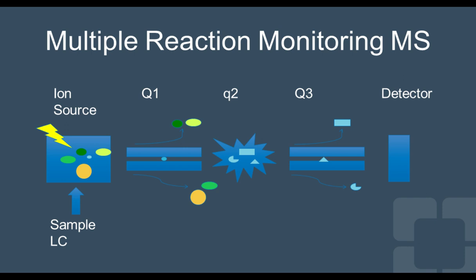Further, we can add additional components. Here depicted, you have a triple quadrupole mass spectrometer, thus called because it has 3 quadrupoles, 2 of them analyzing and 1 not, as depicted as 1, 2, and 3. To work your way through the instrument, first we have the introduction of the sample coming off your liquid chromatograph. Here it enters the ESI, electrospray ionization source, where there is a differential voltage utilized in order to introduce the analytes into the gas phase and Q1.